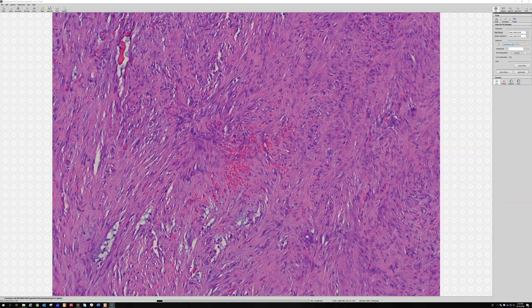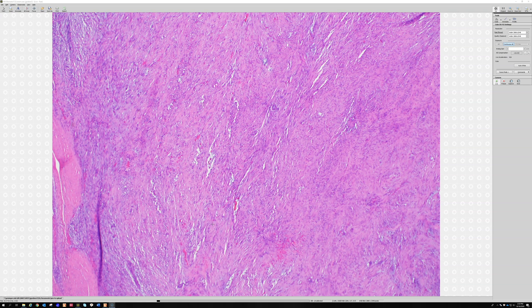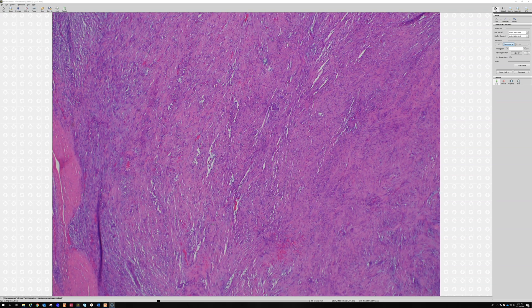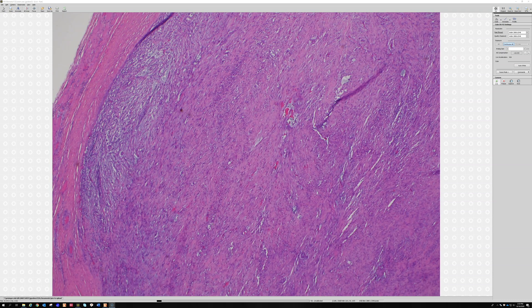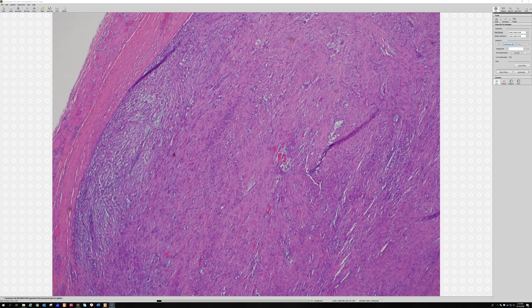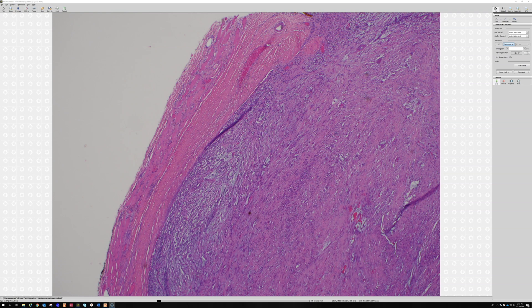You sometimes see keloidal collagen, multinucleated giant cells, and red cell extravasation - many people find that helpful. Nodular fasciitis is usually three centimeters or smaller. If it's bigger than three centimeters, think twice before making this diagnosis. Could you have a four- or five-centimeter nodular fasciitis? Possibly. Fifteen centimeters? No way. The bigger the lesion, the more likely you are to be wrong, so three centimeters is a pretty safe cutoff.